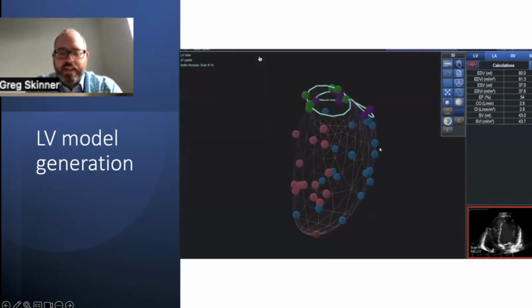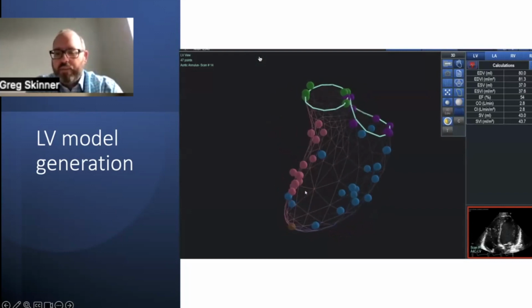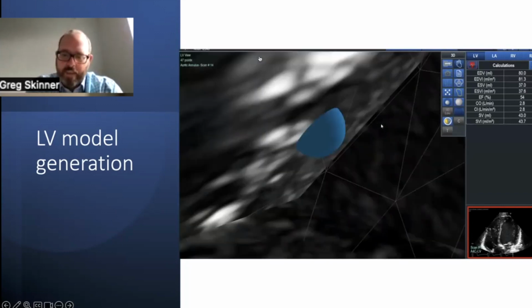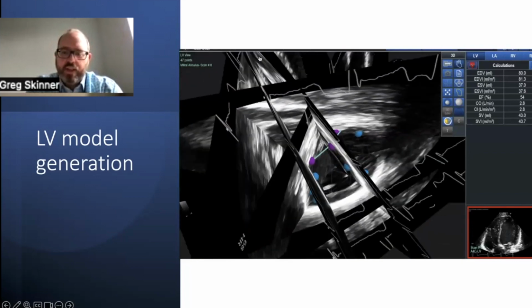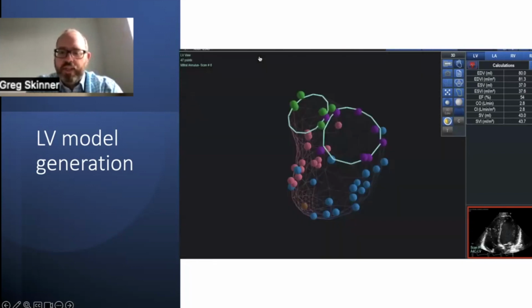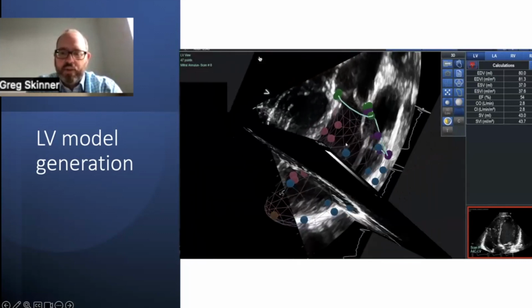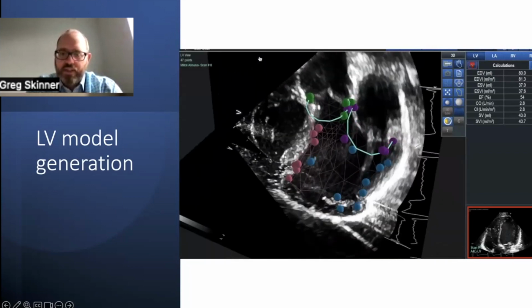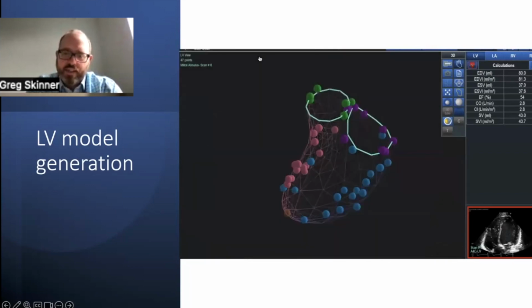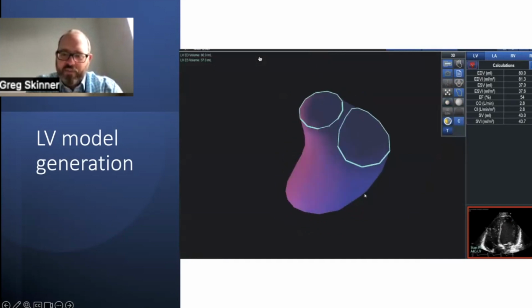And again, we can see here, it's generated this left ventricular volume based on these points. Here I've just overlaid these multiple points together. I think I'll take up a few of these and just show you a long axis and a short axis view here. So you can see how these are co-registered together, and you can see, well, actually that long axis view is partially cutting through one side of the ventricle. So although you think you've cut right the way through the ventricle, you may not necessarily have done so.